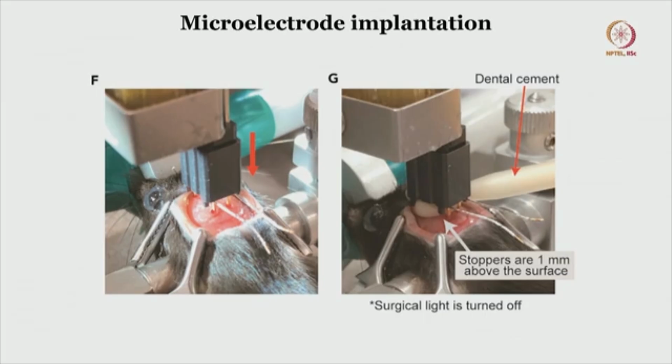there is a difference of the depth that is going to happen, which you need to account for during the depth calculation. So, around 0.2 to 0.3 millimeter, or for example even 0.5 mm of displacement can happen once the CSF comes out, alright. But by and large, you will be able to implant the electrode either onto the surface or even a little bit deeper than the surface of the brain, and you will be able to record decently good electrocorticographic signals, alright.